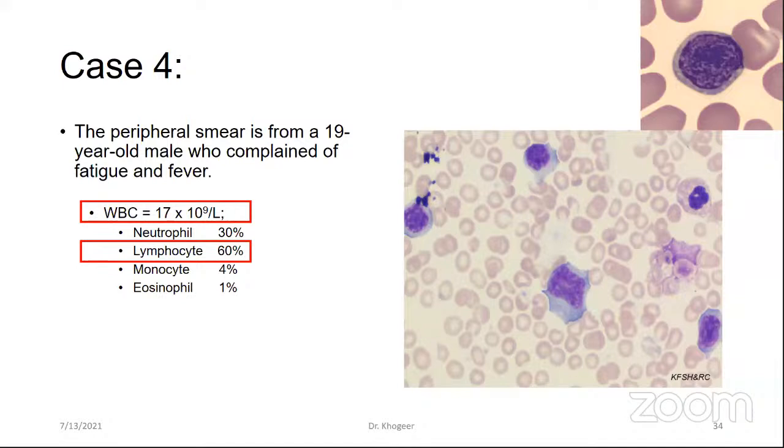An example of non-reactive morphology would be whooping cough caused by Bordetella pertussis. If you want to differentiate the reactive lymphocyte from other variants, the key distinguishing feature of the reactive lymphocyte is its wide range of cellular size and shape, as you can appreciate in this picture, as well as nuclear size, shape, and chromatin pattern.